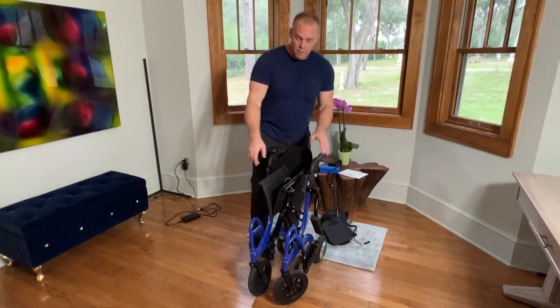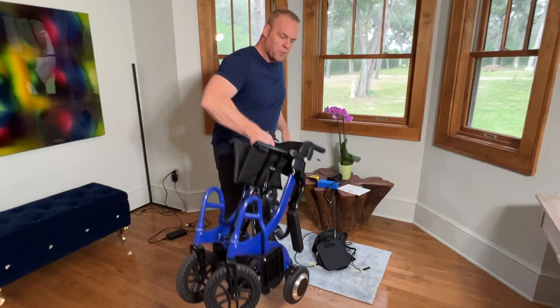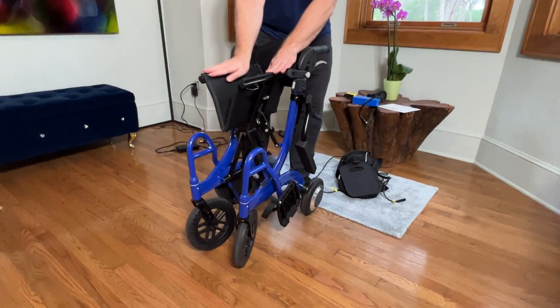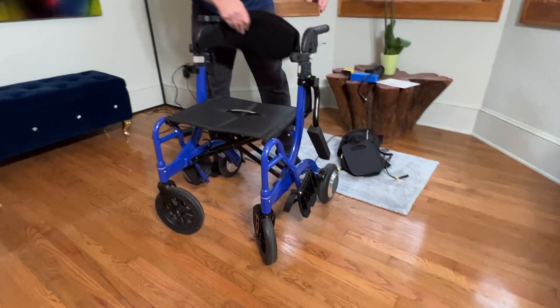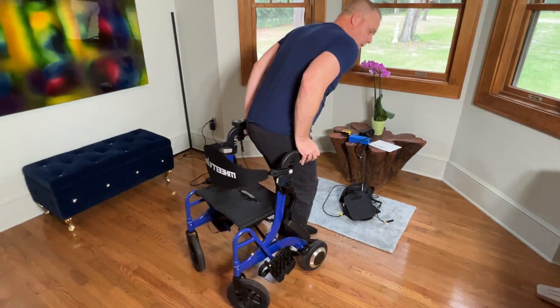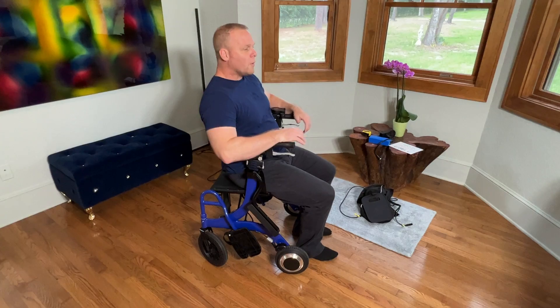It's a sideways folding machine. This weighs just 32 pounds — incredibly lightweight. The handles adjust up and down. It basically is a walker with a seat and handlebars right here so I can rest.